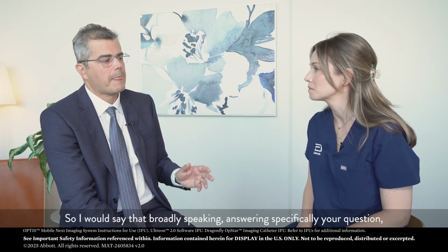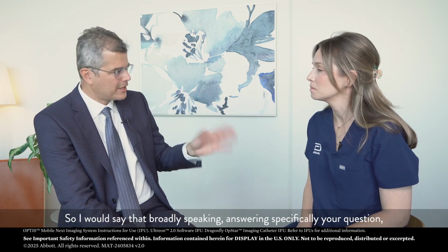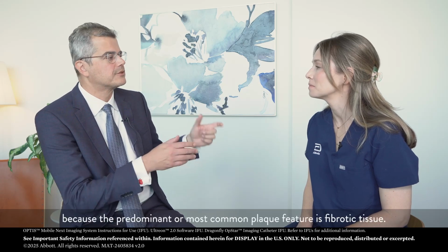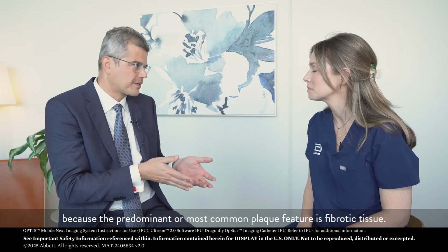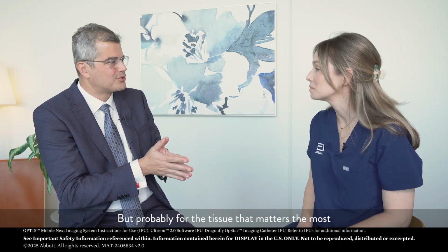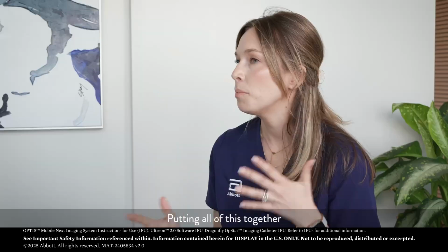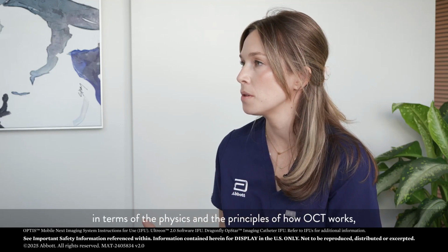So I would say that, broadly speaking, answering your question, IVUS has more tissue penetration than OCT because the predominant or most common plaque feature is fibrotic tissue. But probably for the tissue that matters the most, knowing how thick it is, which is calcium, OCT has an edge on that.